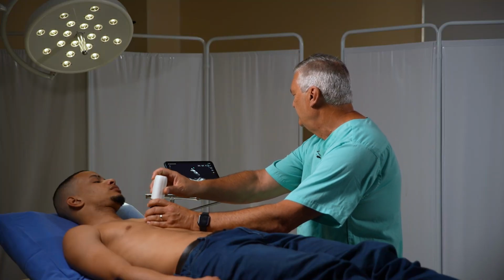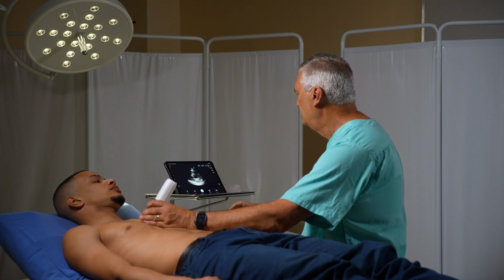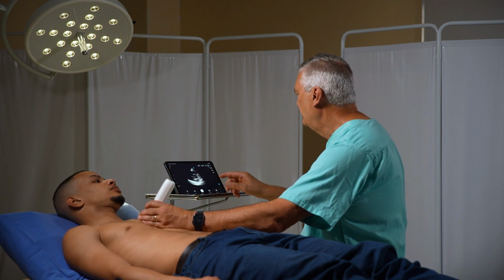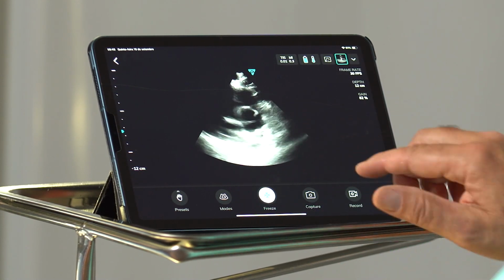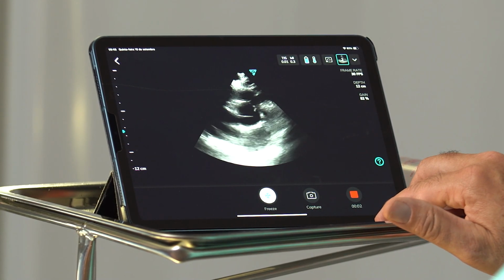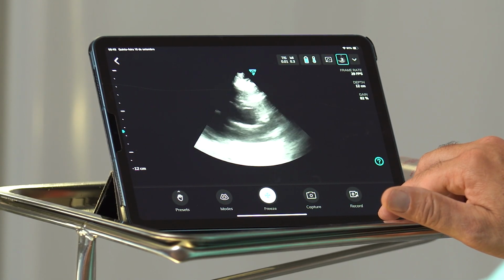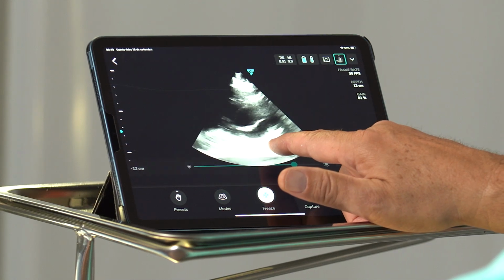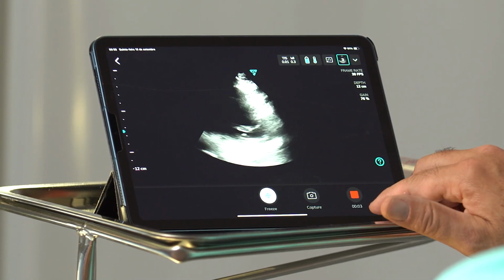go to the short axis, come back up to that aortic valve, and we can see a little bit of the left main coronary artery coming off too. Now I'll clip this. Clip that mitral valve.